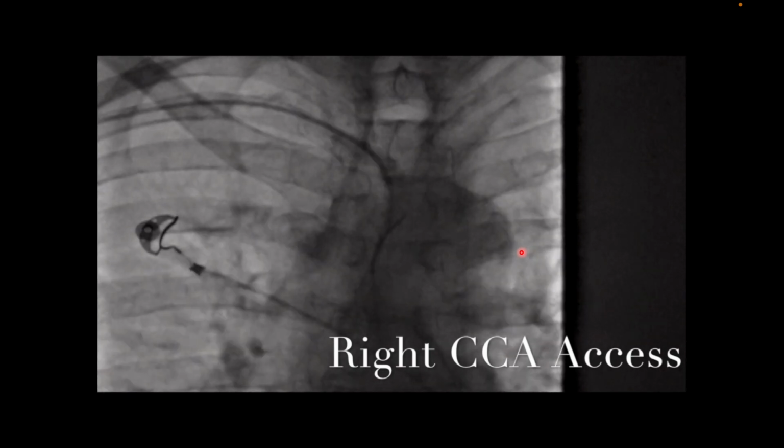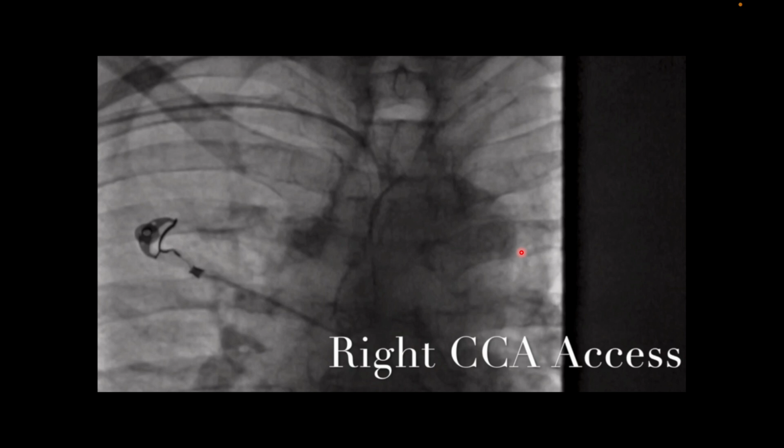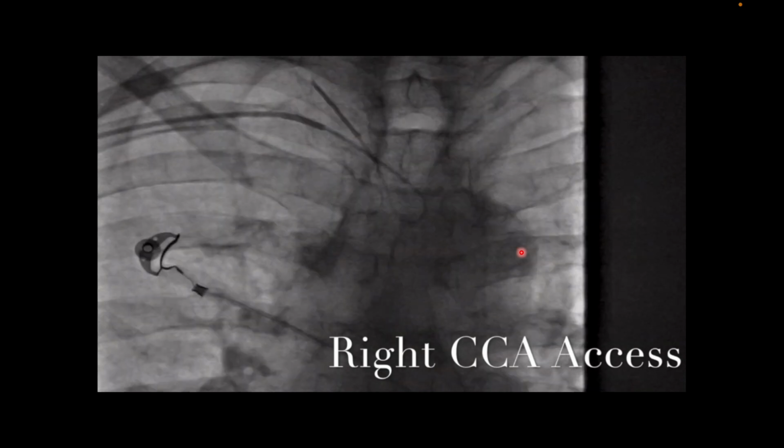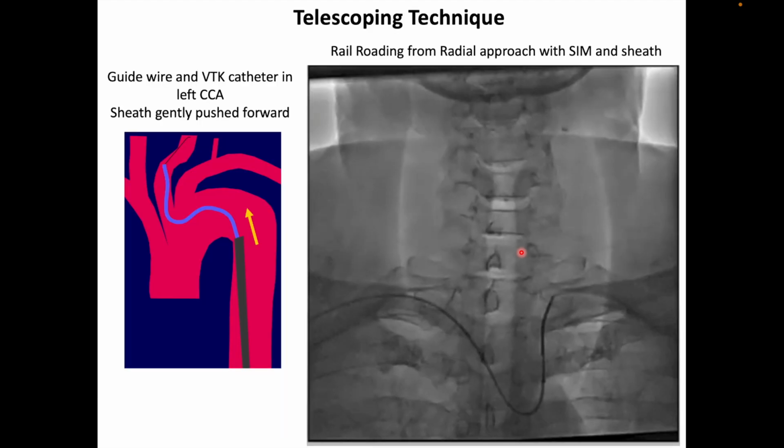Now, if you want to come from the radial or the brachial access, it's the same thing to engage the right. We shape them in the ascending aorta, and then while pulling it up, it automatically goes into the right common carotid artery. It's not difficult to engage from the arm approach as well.